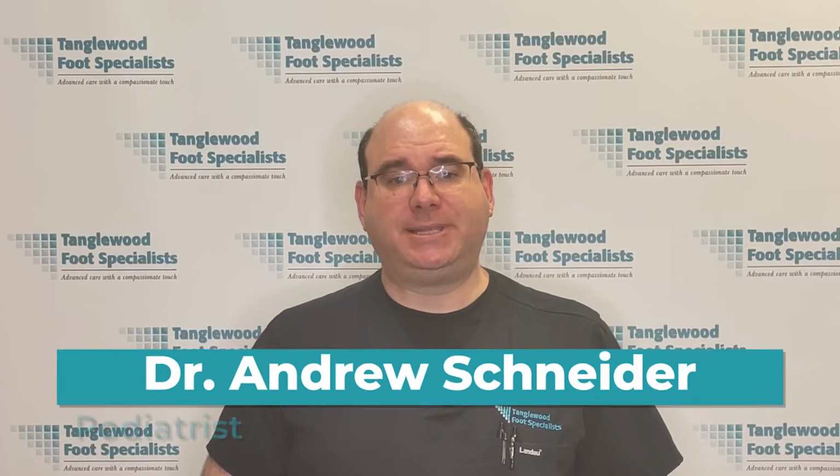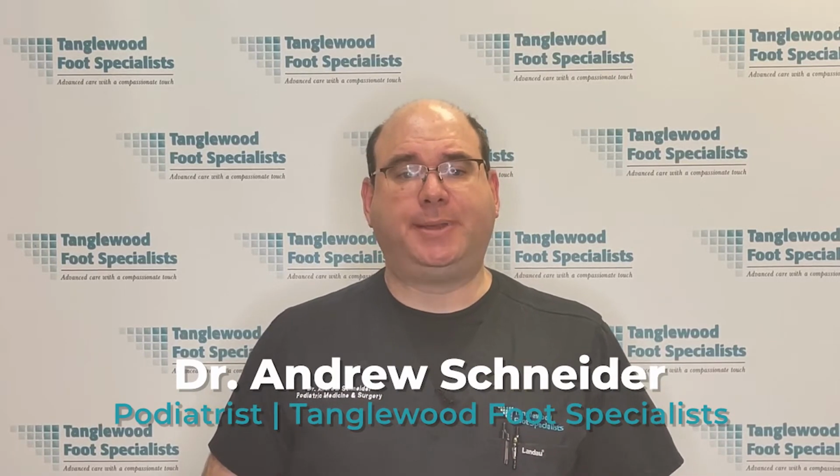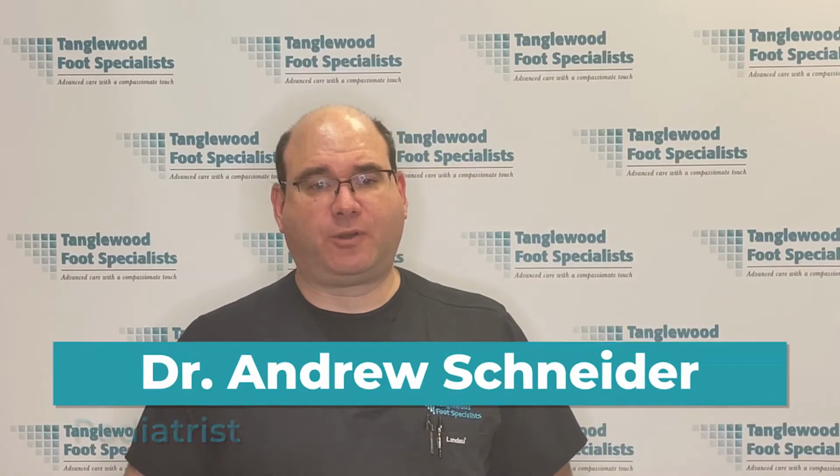You may have been told at one point or another that custom orthotics just don't work. You may have a friend who used one and it didn't help them. My name is Dr. Andrew Schneider, and I'm a podiatrist in Houston, Texas. This situation can occur for one of two reasons. Either the orthotic was poorly made and didn't provide enough support, or the foot and ankle required more support than an orthotic is able to provide.